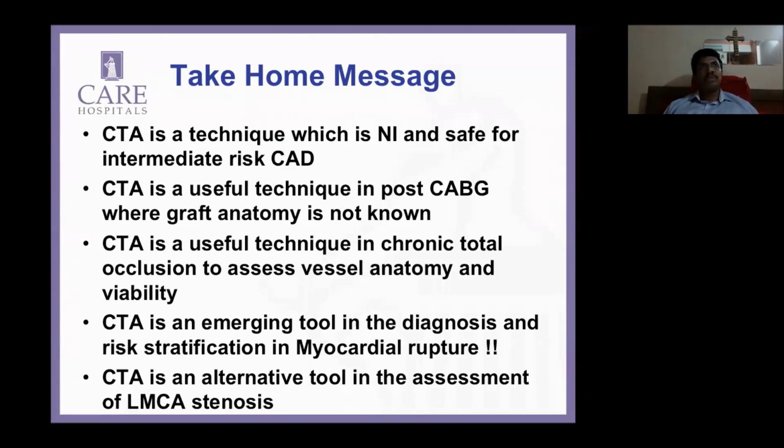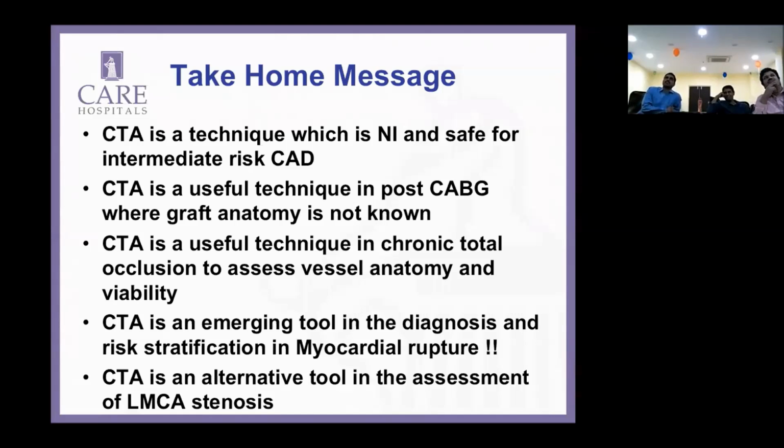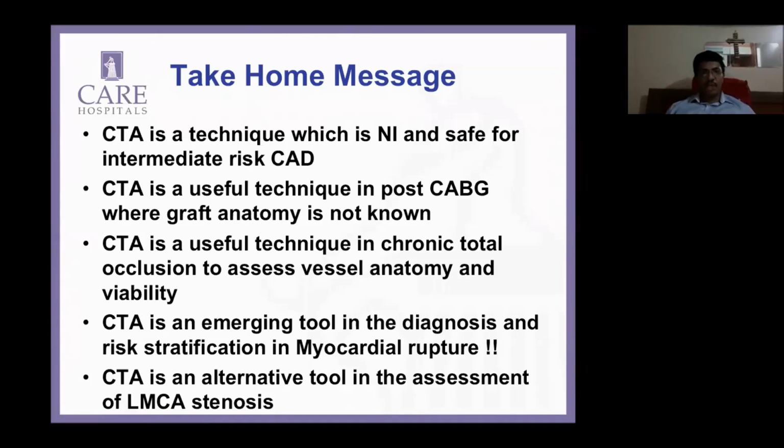Johan sir, what's your take on FFR CT in the present scenario? Yes, if I heard the question right, it's about FFR CT. I've had a chance to visit the home of FFR CT, that's Redwood, California, and it's a great tool. In fact, if you look at all three trials, including Discover and the other two, there is very close concordance with invasive FFR. And the best part is, this is such a beautiful technique. We don't need to give anything extra. We don't give adenosine. We don't give extra contrast. It's just a simple CT data set which you export to a lab in California.